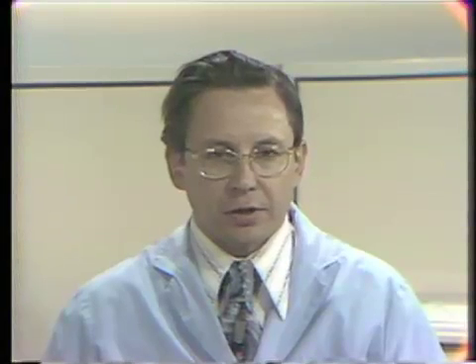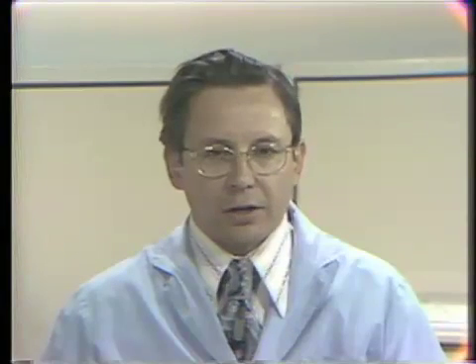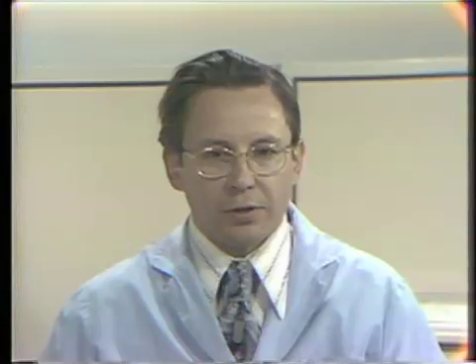The object of this presentation is to demonstrate the use of a dental assistant during periodontal surgery. We will show from start to finish everything that an assistant does to assist the doctor during such activities. At first, we'll show the operating room completely set up by the assistant, then the seating of the patient, administration of the anesthetic, the assisting during the periodontal surgery, the placement of the sutures and the dressing, the writing on the record of the procedures performed, the instructions to the patient, and the dismissing of the patient.